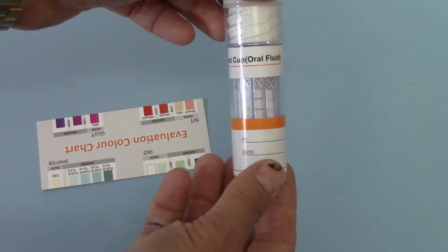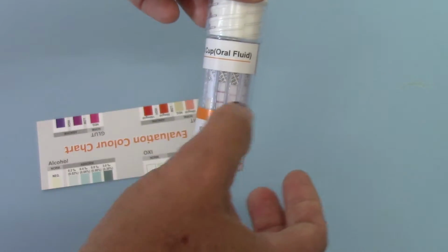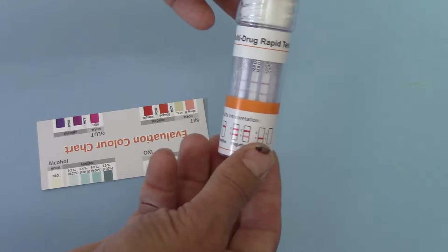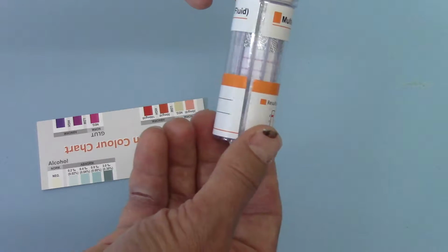If we then run you round the 11 drug tests, you're looking for the presence of a control line, which is the top line forming nearest the top of the test, and you're looking for 11 of those to have formed. So if I rotate round, you can see nicely that we have all 11 control lines showing beautifully.